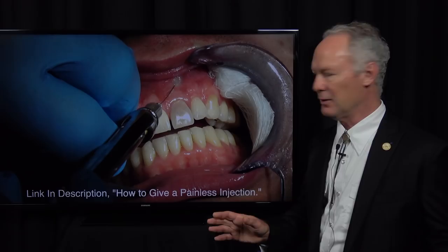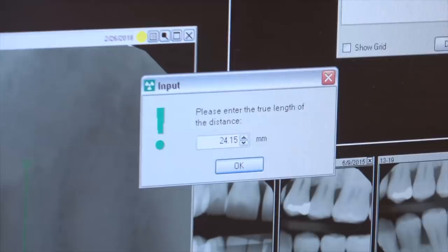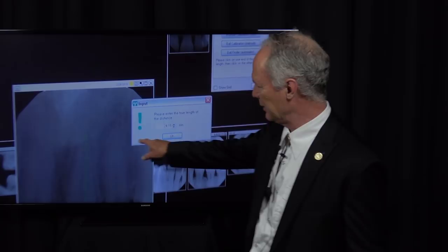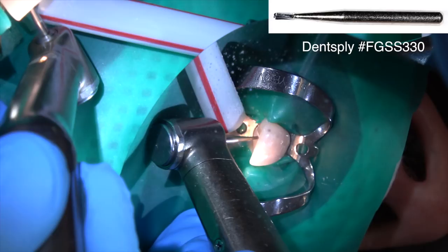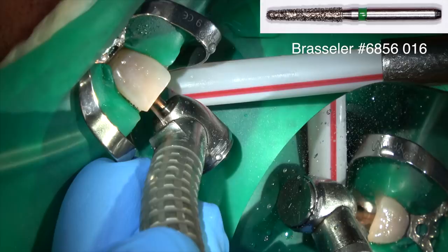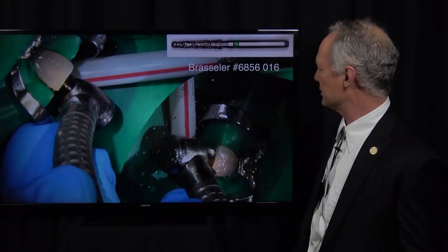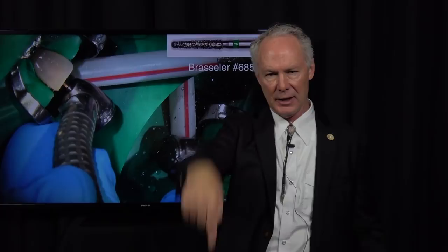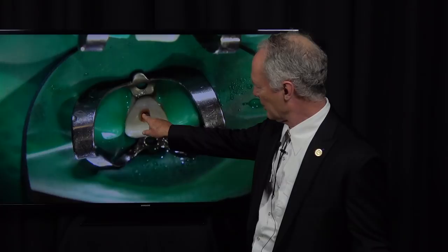It's a tremendous practice builder, especially when you're working in the anterior region. You can see how dark this tooth is. I'm first getting a measurement with my digital application — this is about 24 millimeters from the apex of the tooth to the incisal edge. I've placed our rubber dam and then I'm using a 330 carbide burr to open the tooth into the pulp chamber. You'll feel it just fall in there. Then I'm coming back with a coarse diamond and just opening the chamber so I've got straight access to the root canal.